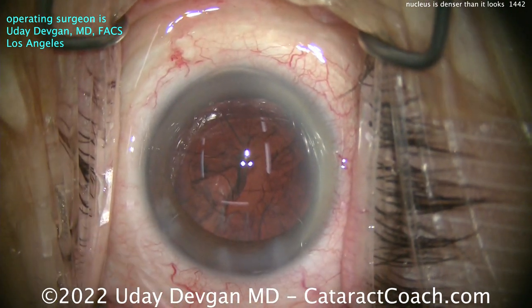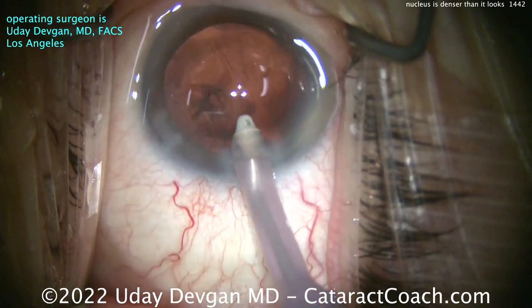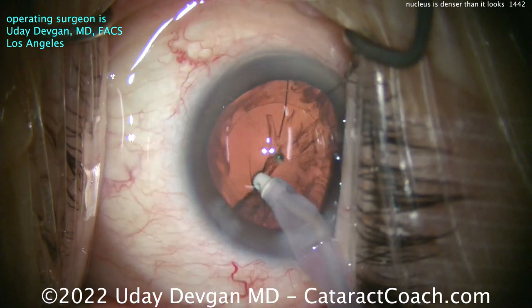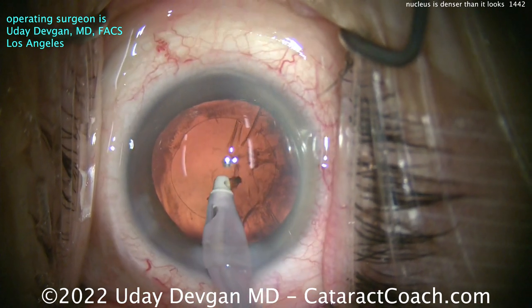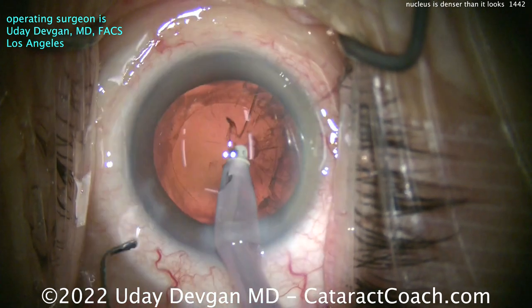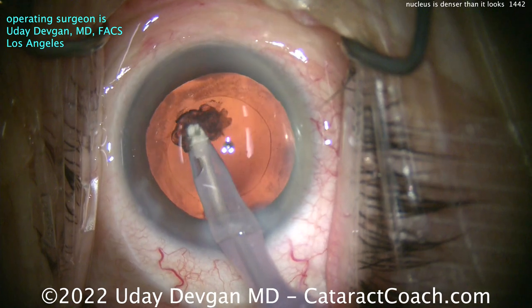Nicely removed cataract — all looks pretty good. You can see the outline of the incisions. I'll switch the camera lighting to emphasize the red reflex, which means turning on the coaxial lights brighter than the paraxial light. We'll clean up the cortex. This patient is elderly, so we want to be cautious about zonular support. As I'm removing the cortex, I'm also watching the capsulorrhexis edge — I don't want to see that edge moving at all, because movement there means zonular weakness.